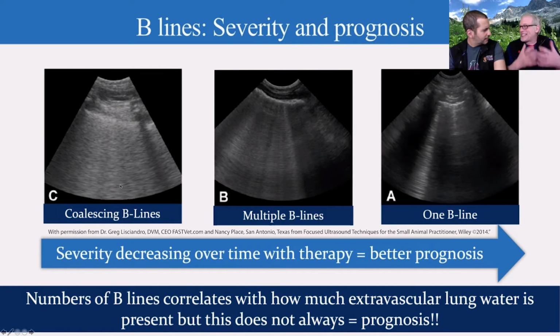What? So we can track serially for response to therapy, either good like furosemide or bad because Chalhoub is giving it fluids. You're saying that's a bad amount of fluids? I'm saying 1,000 mLs per kg, 5 minutes repeated 3 times is a little too much fluid, and we will actually see it get worse. Not to worry, we can pick that up. Okay. Hopefully earlier than C. We can pick it up at B. That's why they don't want me to work emergency anymore.